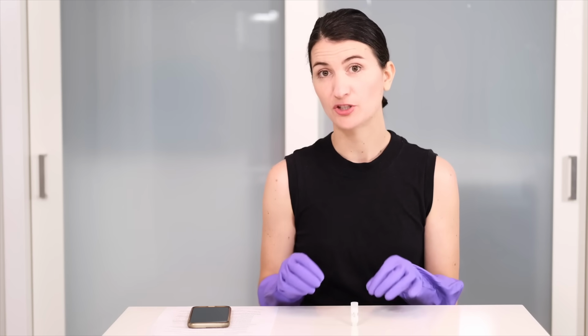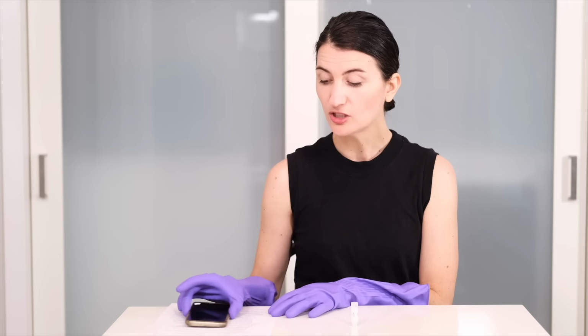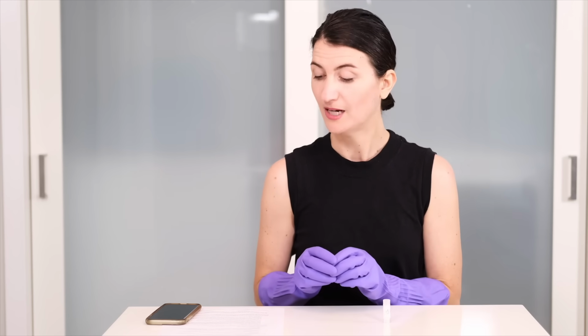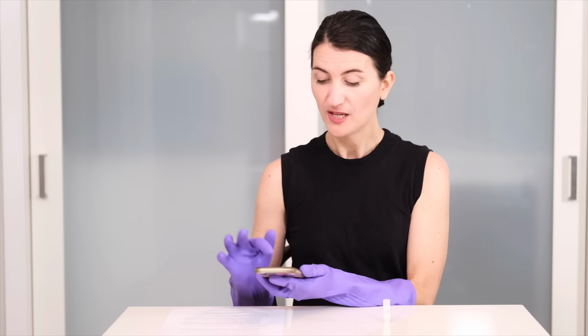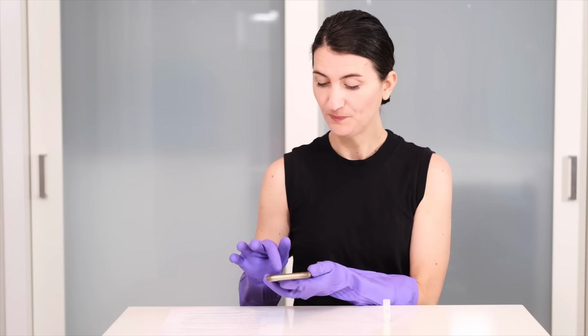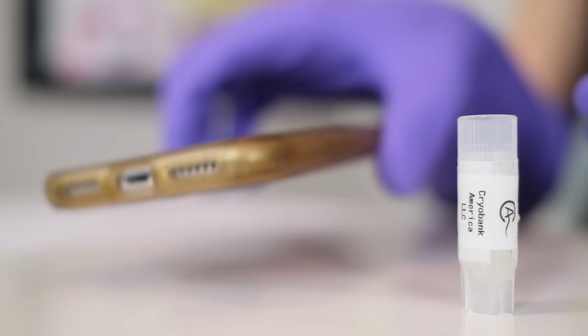The next step is to thaw it. So at this point, you want to follow the instructions from your sperm bank. And today we're following Cryobank America's instructions, which actually are very simple and straightforward. They recommend that you set it on the table or set it someplace for room temperature for 30 minutes. And then you come back and it should be liquid. So we are going to set a timer, and we'll start that now.